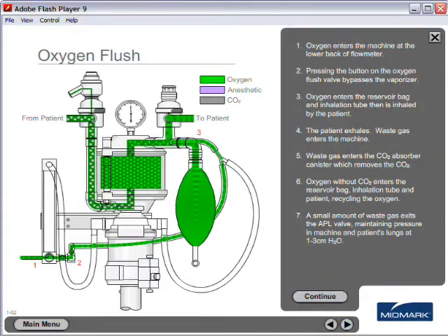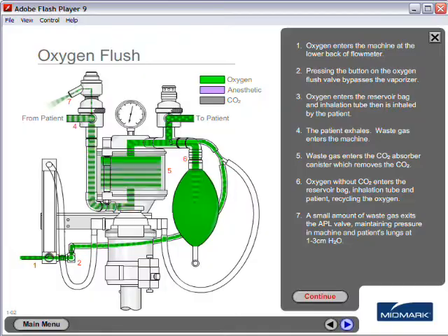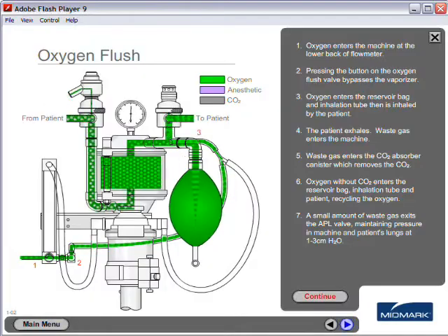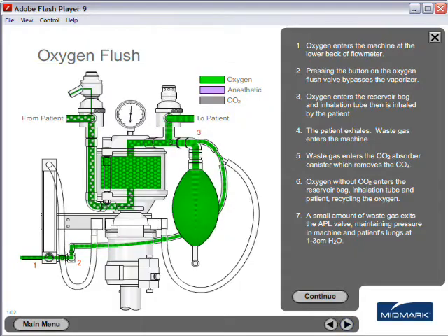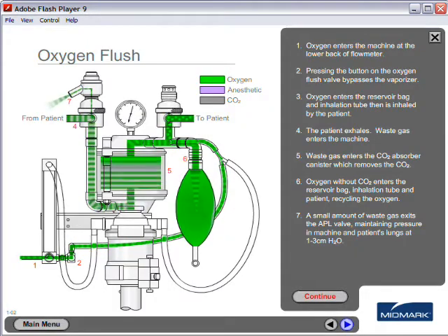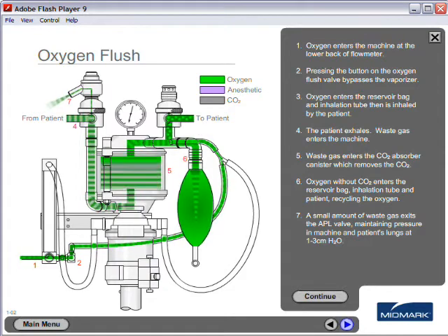Oxygen flush. Oxygen enters the machine at the lower back of the flow meter. Pressing the button on the oxygen flush valve bypasses the vaporizer.